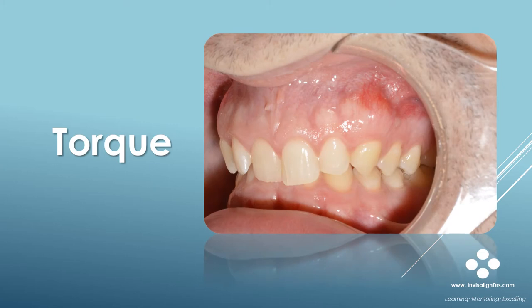Here's a before photo of a patient I've treated. The anterior deep bite in this case is obvious. Note also the lingual inclination of the upper incisors. This case requires anterior torque. Understanding how to manage torque with Invisalign Treatment is the key to obtaining an excellent outcome.